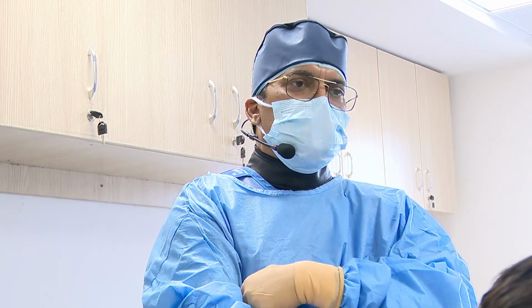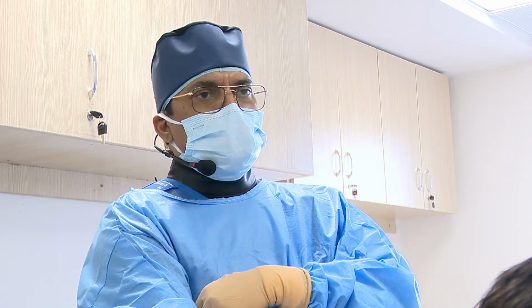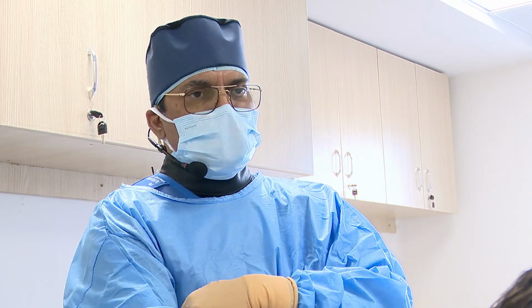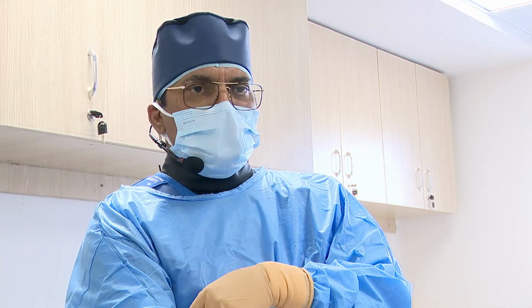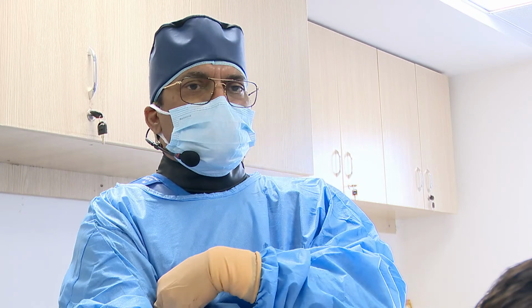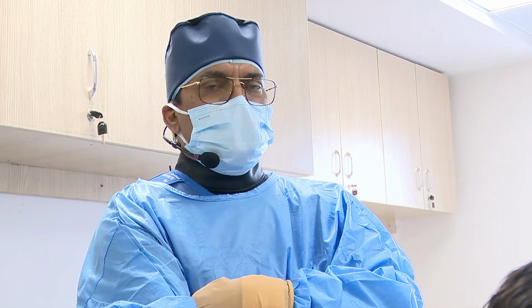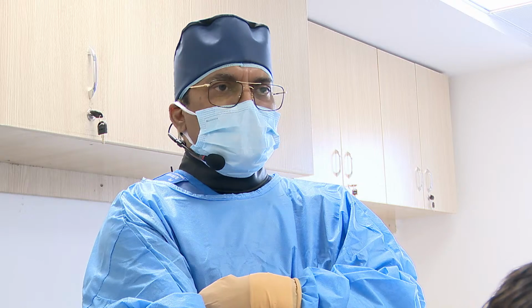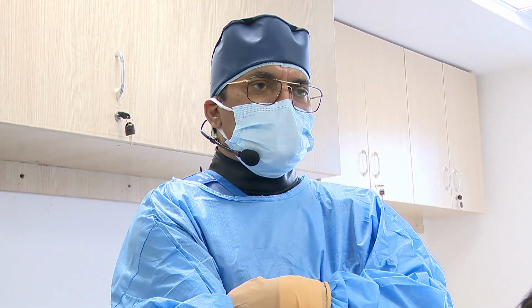Even the distal tip is only 23 in the previous version, and another advantage of this catheter is 27 mm versus 23 mm lens length, so that you can capture some more length. We wanted to use the 27 mm versus 23 mm catheter so that you can capture some more length. So these are the advantages of this OCT catheter.